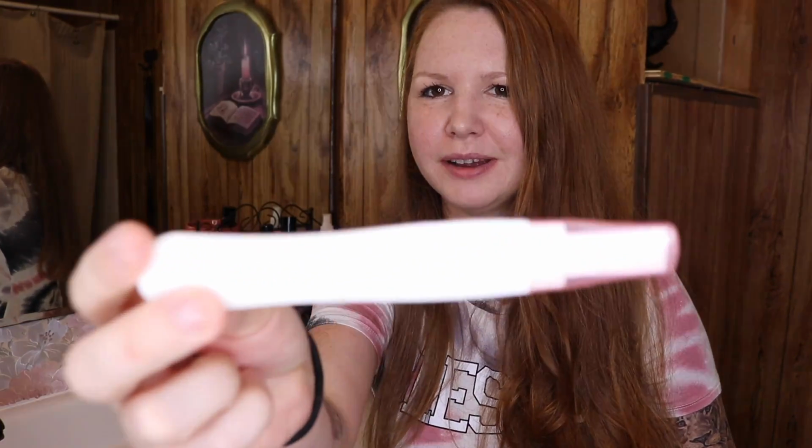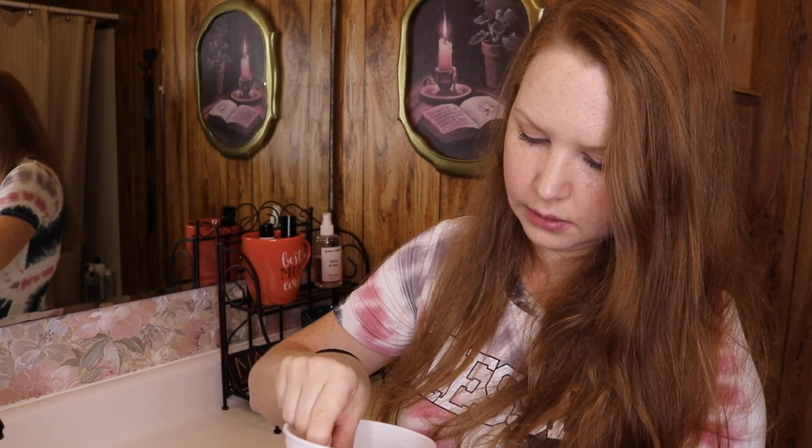This pregnancy test actually looks a lot like the first response pregnancy test. But I'm gonna go ahead and take the test now. My husband did just get home, but he's gonna be outside cutting grass. Now, if this test shows up very negative, then I do want to drip some water in it and see if that line disappears, because I've heard if it's an evaporation line and you put water in it and that line goes away, then that's exactly what it was. I read the instructions and it said dip for 5 seconds. It's going across now.